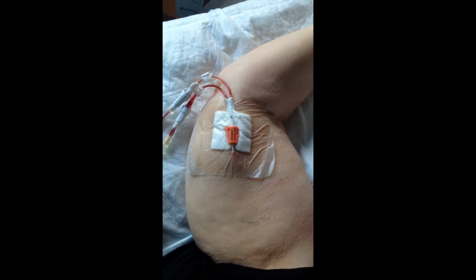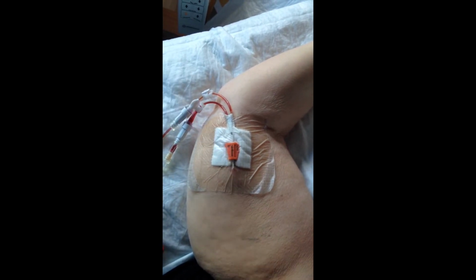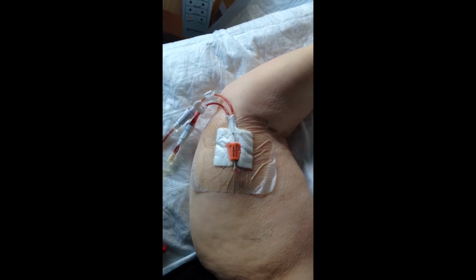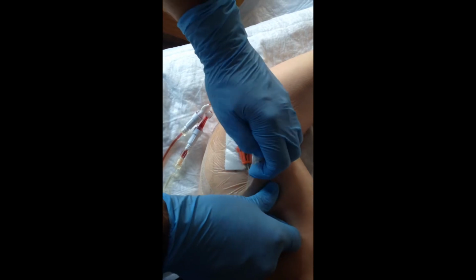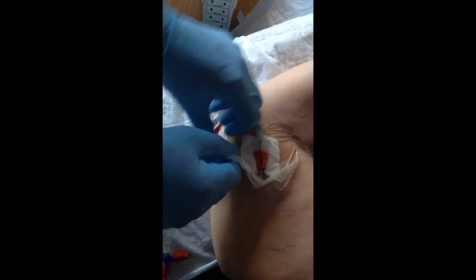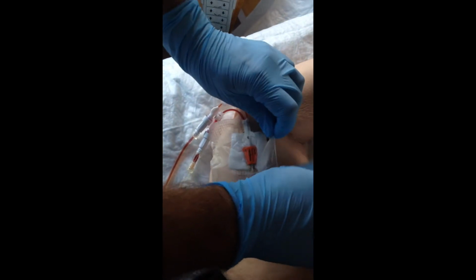We are going to remove now the midline catheter secured with SecurAcath. This patient had the midline 15 days. Part one is to remove the tegaderm. This can be done with regular gloves.